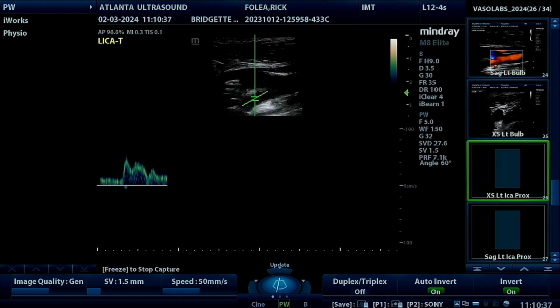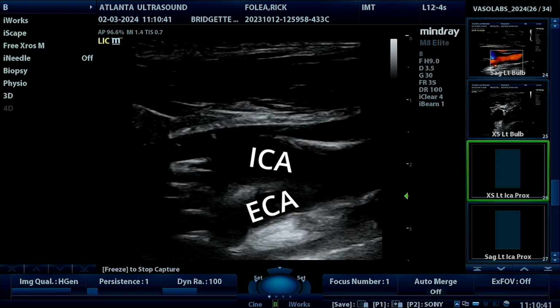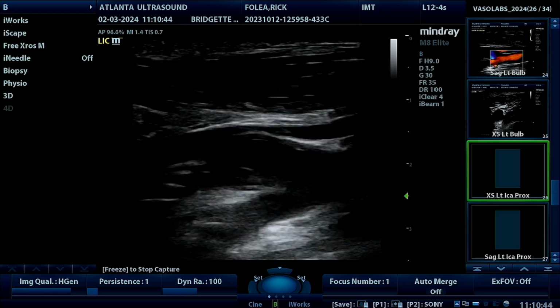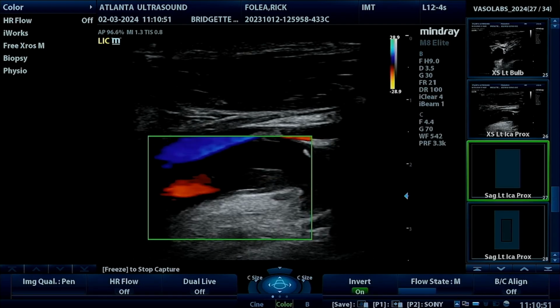Do a quick audio check. And we see this is the ECA because the waveform has that characteristic jagged abrupt form. Now, while it's unusual for the ECA to be at the bottom branch, everyone's anatomy is different, so it's good we checked. No problem. We just move to the upper branch, which we now know as the ICA, and we do a flow check for hidden plaque.